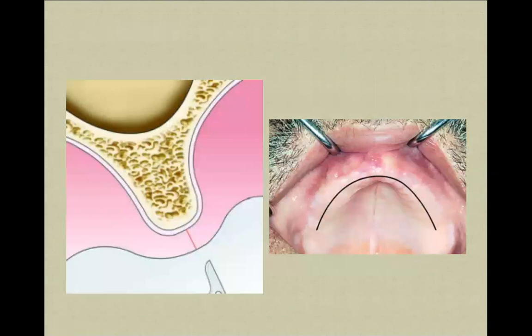Okay, let us start step by step. So, first step, we did our anesthesia. You can find it here. This is total edentulism of the maxilla. There are no teeth here. So we are making just local anesthesia here on the vestibular fold. I will not do infiltrational anesthesia here, because it is ridiculous.